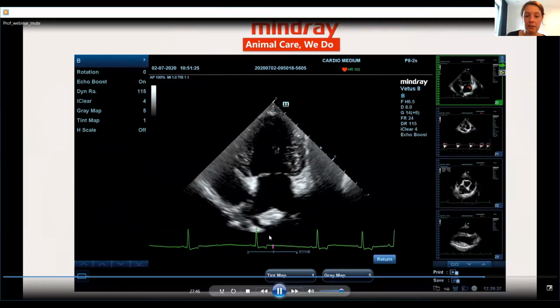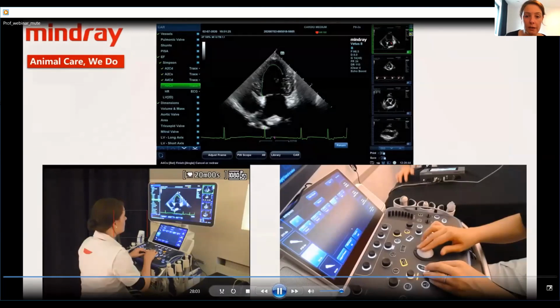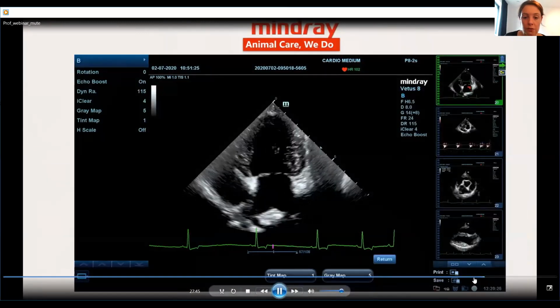Here you saw again how I choose the moment to measure the systole. So we are here behind the T wave, but I actually chose the moment again right before the opening, the closure of the valve. Wait, I will try to go back. Okay, here we are in diastole.